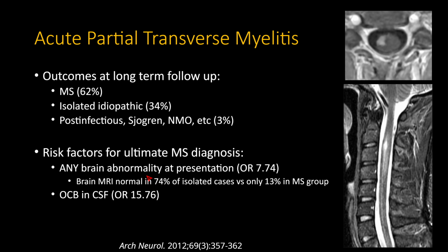So it's important, I think, that the first step after you see a lesion like this is brain MRI. If the MRI meets MS diagnostic criteria, you can forego lumbar puncture. And in fact, that case I showed you, the patient never got a lumbar puncture because they had MS and it looked like MS, just had a very limited mimic laboratory workup. However, if the brain MRI was normal, then it probably makes sense to look at the CSF. And if you see oligoclonal bands, that makes them high risk of developing multiple sclerosis, and you can sometimes even treat these patients as long as they're high risk.